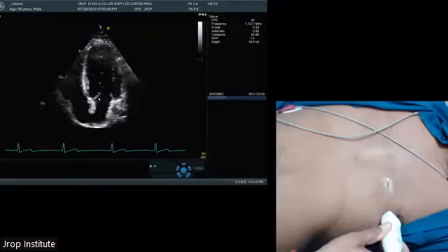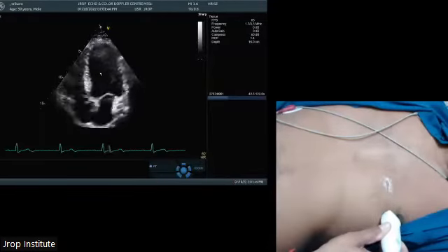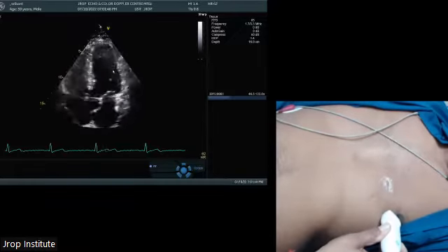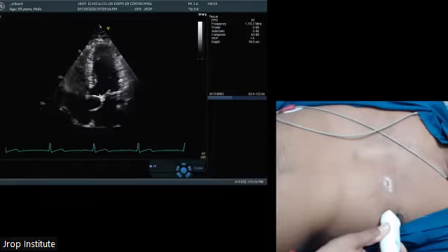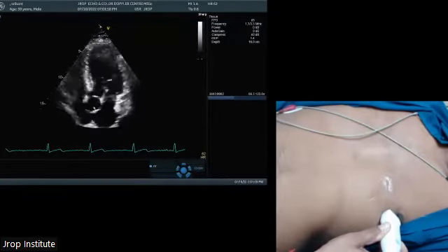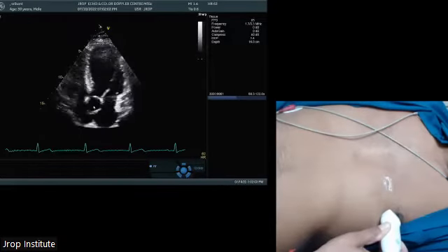Right? So this is the 4-chamber view. This is the 5-chamber view, and this is known as the anterior septum. And this could be posterior or it could be lateral wall. So we do not count territories for wall thickening abnormality in the 5-chamber view. This is known as the LVOT area, and this is known as the aortic flow area. Before the valve is LVOT. After the valve is the aortic valve.